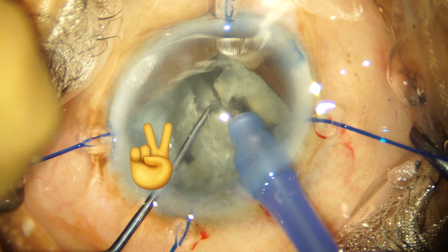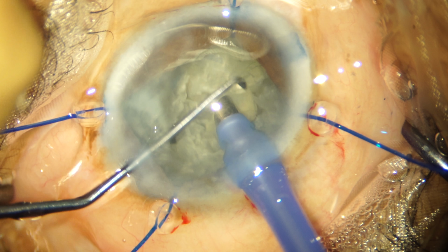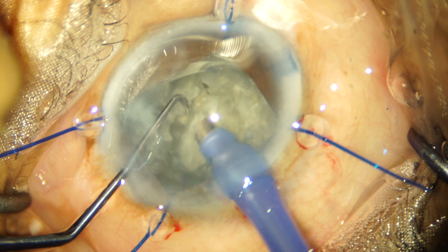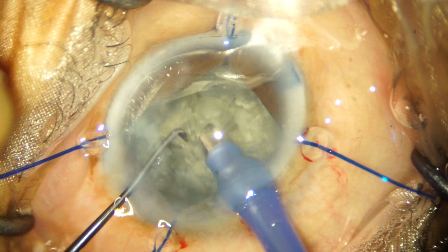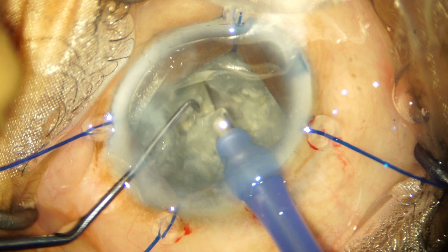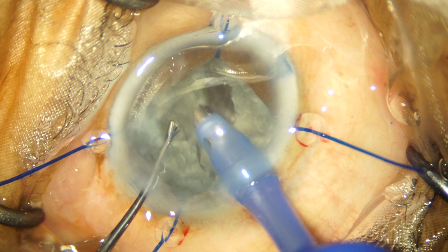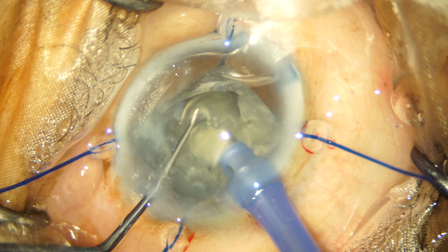And I've achieved success in this endeavor. I have managed to break the posterior plate. So I am emulsifying the partially broken posterior nuclear plate because it prevents the other nucleus fragments from prolapsing out of the bag. Once the nuclear plate is out of the way, the nuclear fragments will come out of the capsular bag in a much easier fashion.